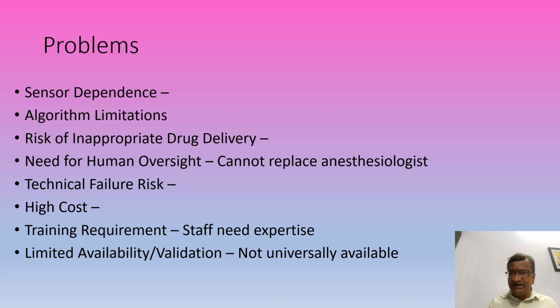Okay, now these are the advantages. Precision, less drugs, all these things are advantages. It consistently does this. The anesthetist can relax. All these things are advantages.